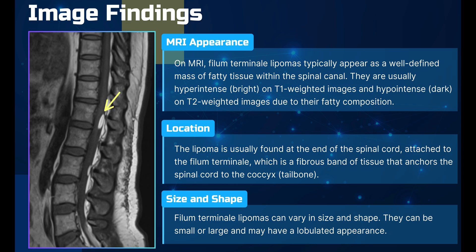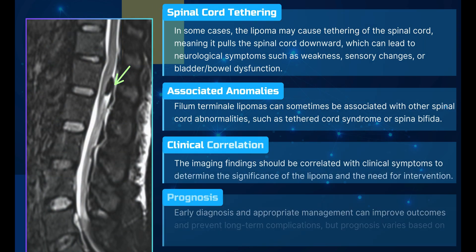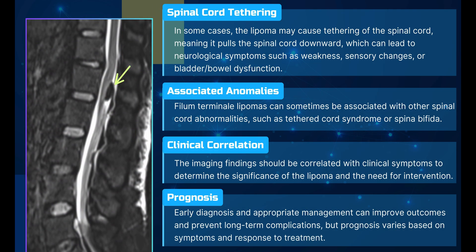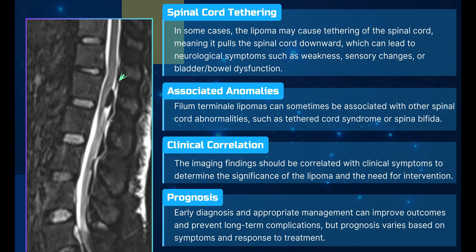A T1 and T2 bright lesion which is suppressed on fat saturation sequence should give the diagnosis. This is the fat saturation sequence — you can see the suppression. The lesion is dark on this sequence.